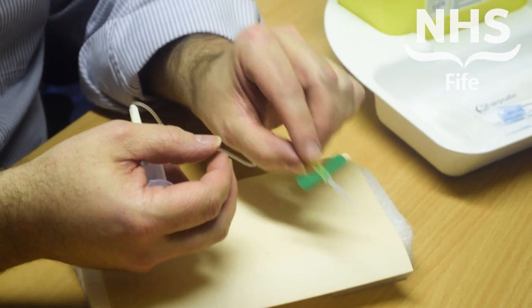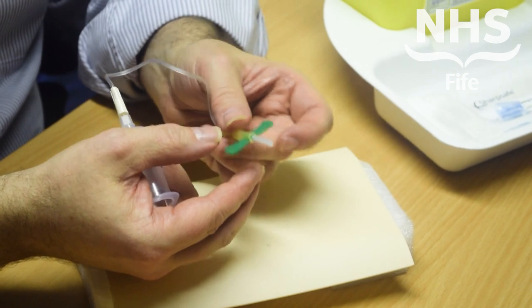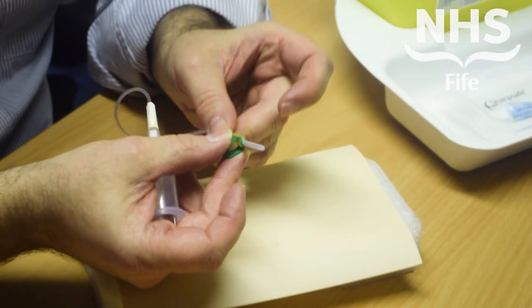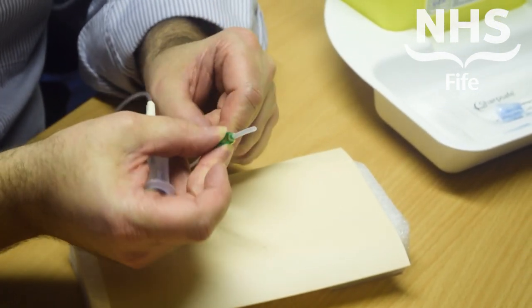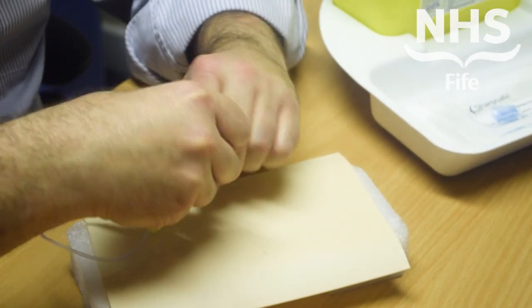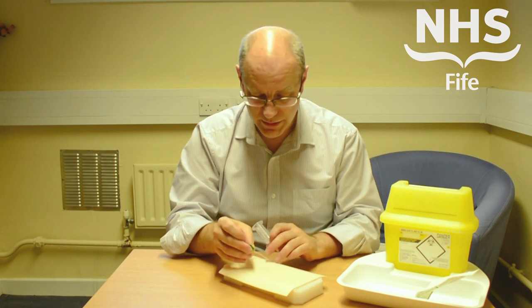To use the device, you want to grip the needle initially by the wings of the butterfly. You'll see there's a textured side and a smooth side — you want to be folding the textured side up and using those to hold on to. Remove the needle protector; again, that can just go into your normal domestic waste.